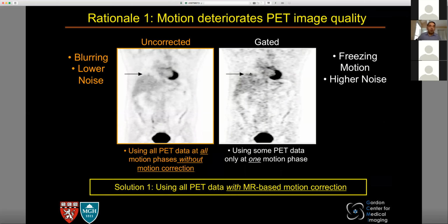And that's what we called the 4D PET, gated PET, 4D PET CT. We looked at several examples 20 minutes ago. But the problem with this, as Penina mentioned, was that here you have a lot higher noise because you have fewer counts. So the question is, can I improve the contrast without sacrificing the noise, so that I can improve my signal to noise ratio and not just improve my contrast, but not deteriorate my noise? And the answer is yes.